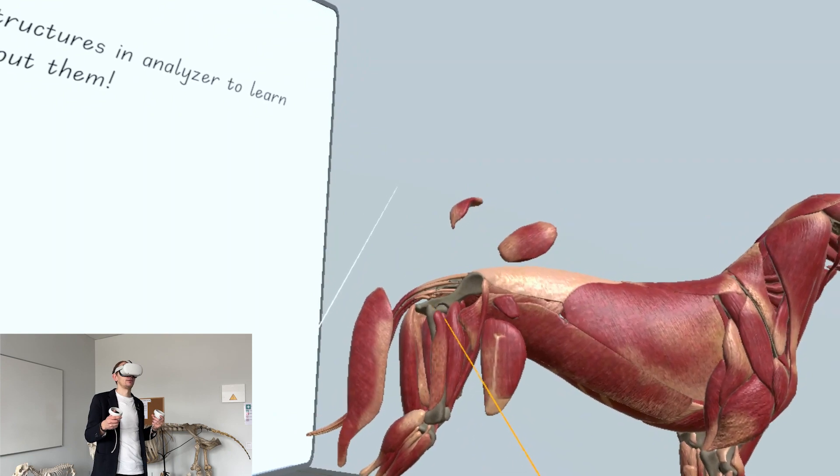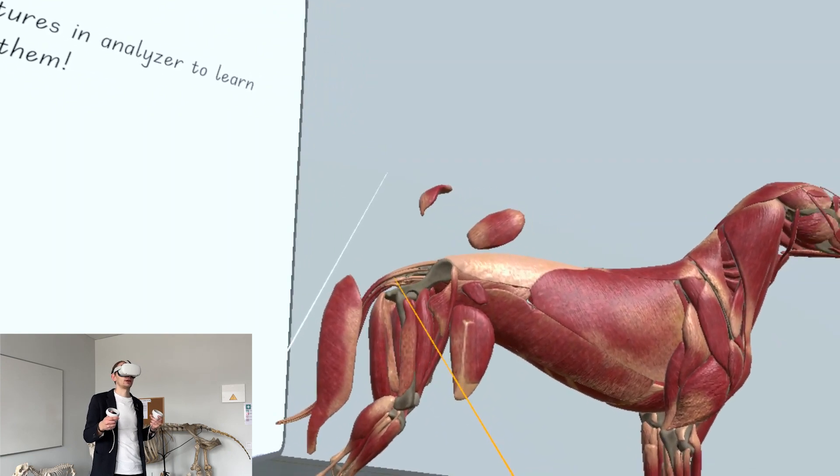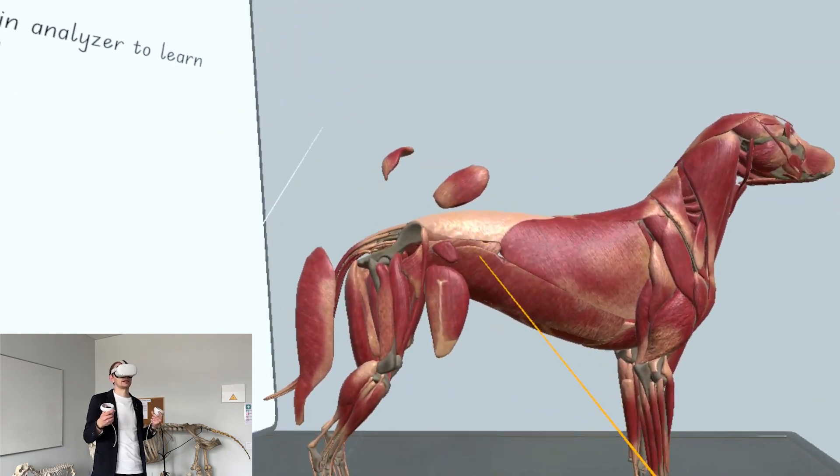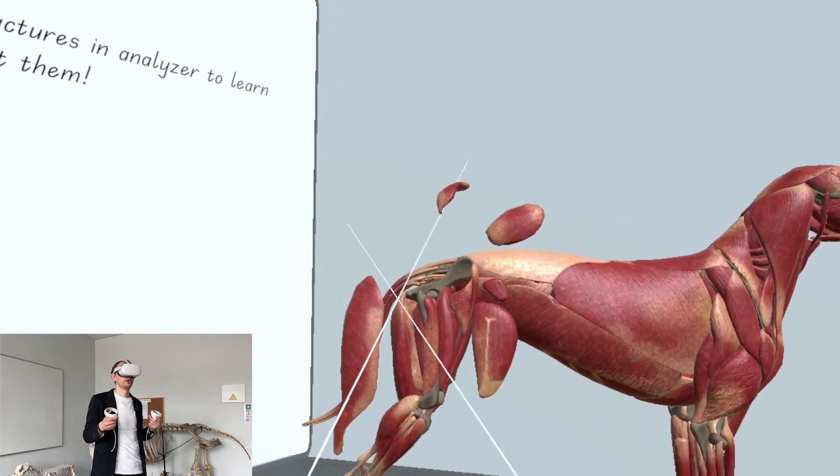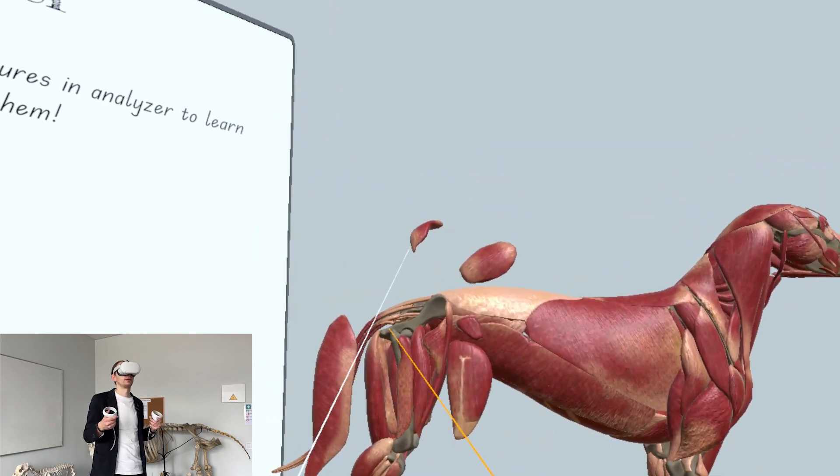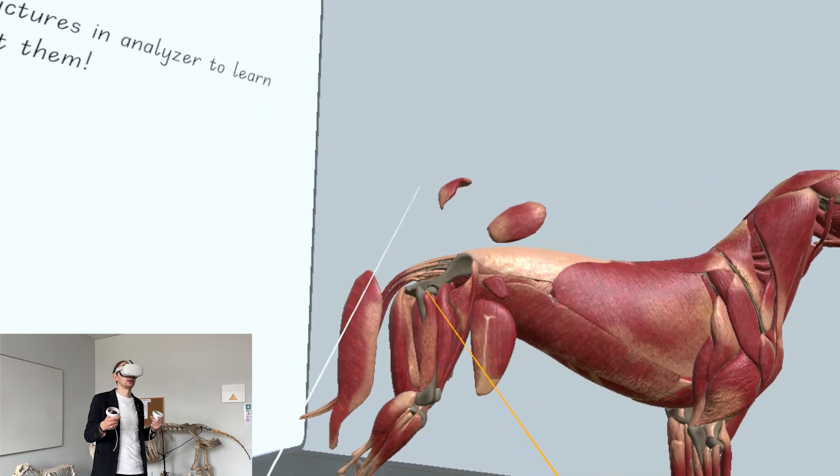The main goal is to cut at the femoral neck. Once the femoral head is removed, there will be no tension, no rubbing between the bones, and it will help the animal so it won't be limping.